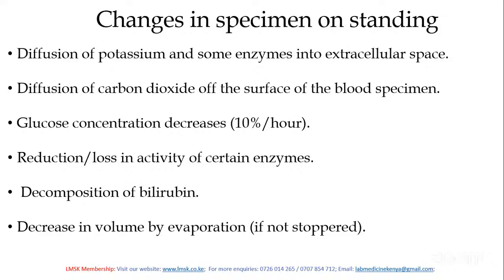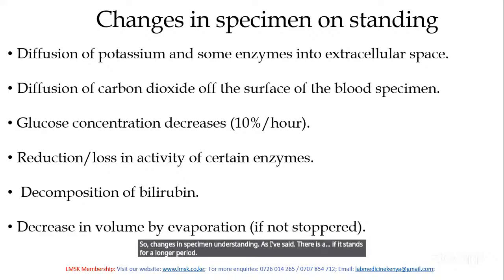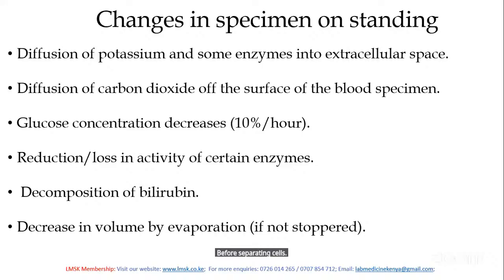So, changes in specimen on standing. As I've said, if it stands for a longer period before separating cells, there's a diffusion of potassium into the extracellular space. There's also diffusion of some enzymes into the extracellular space. If we say enzymes are intracellular, that is their location, then they are meant to work inside the cell.